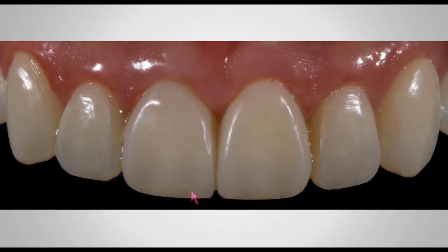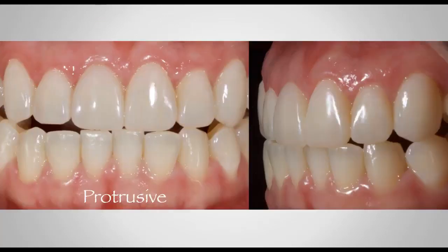Now this is a single shade. This is a monochromatic flowable composite, so I use probably A1 or B1 for this case, and those are the shades that I normally use. But you can see that since the flowable composite has different thicknesses from the gingival all the way down to the incisal, you can see a little bit of translucency effect created even throughout this single shade composite on the incisal third. So again, you end up with a very nice prototype restoration that is bonded. This is not going to go anywhere. Patient is ready to go home and just start.